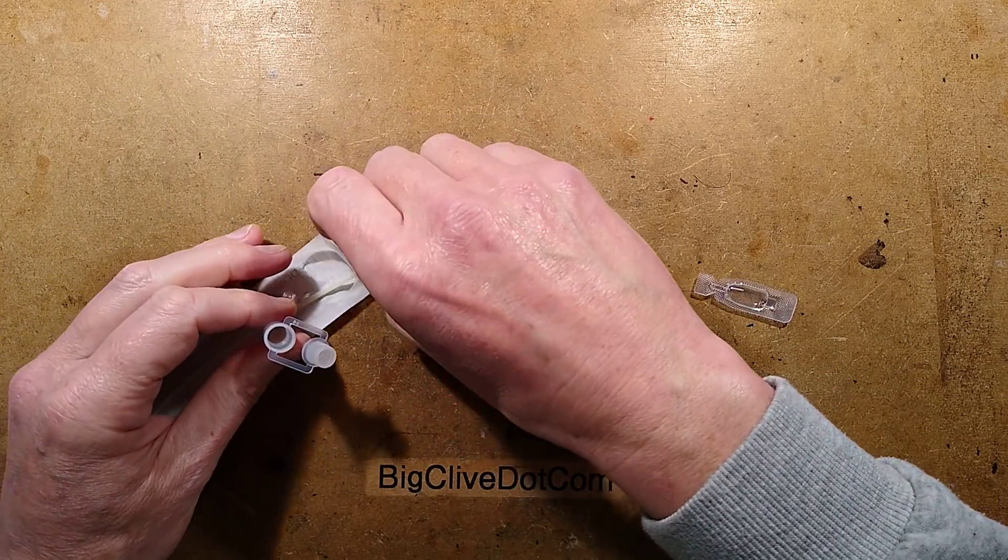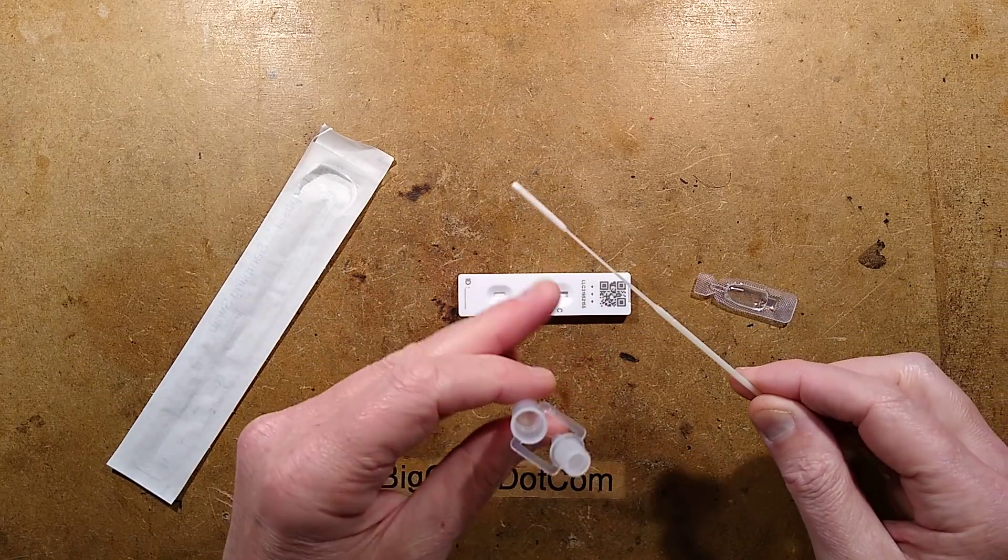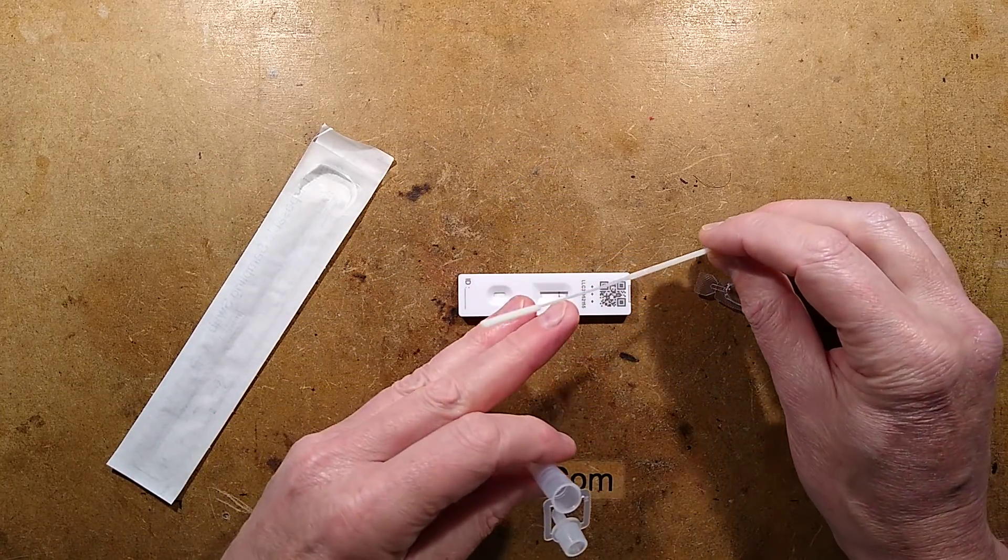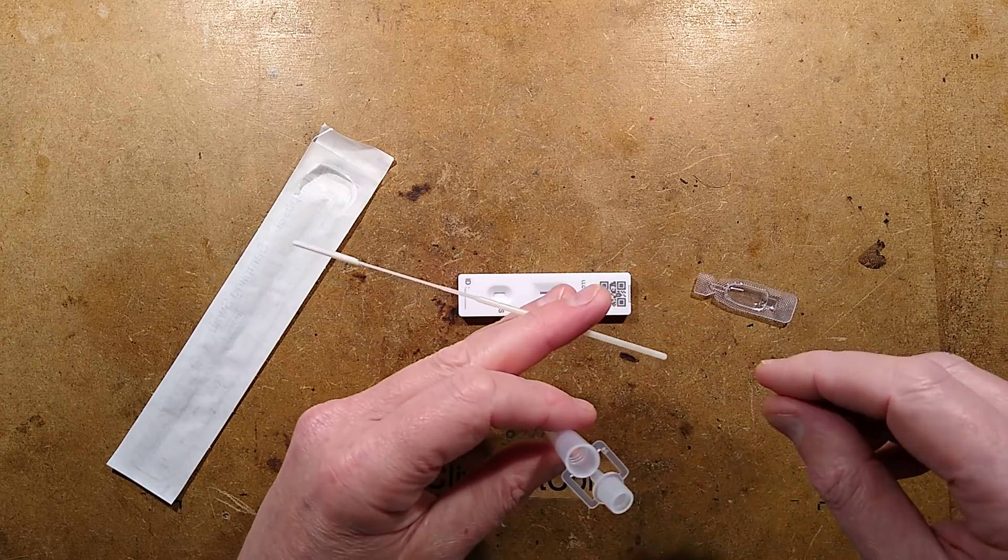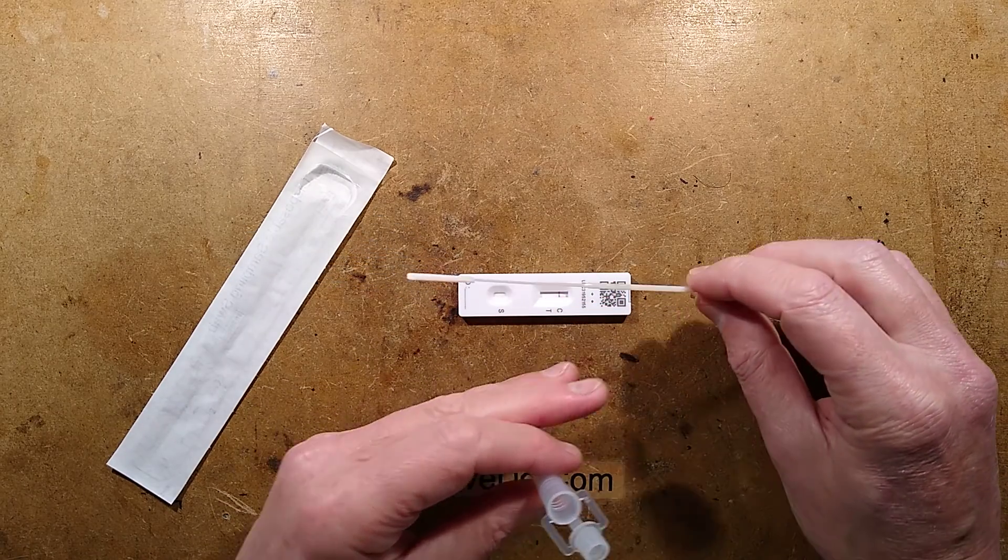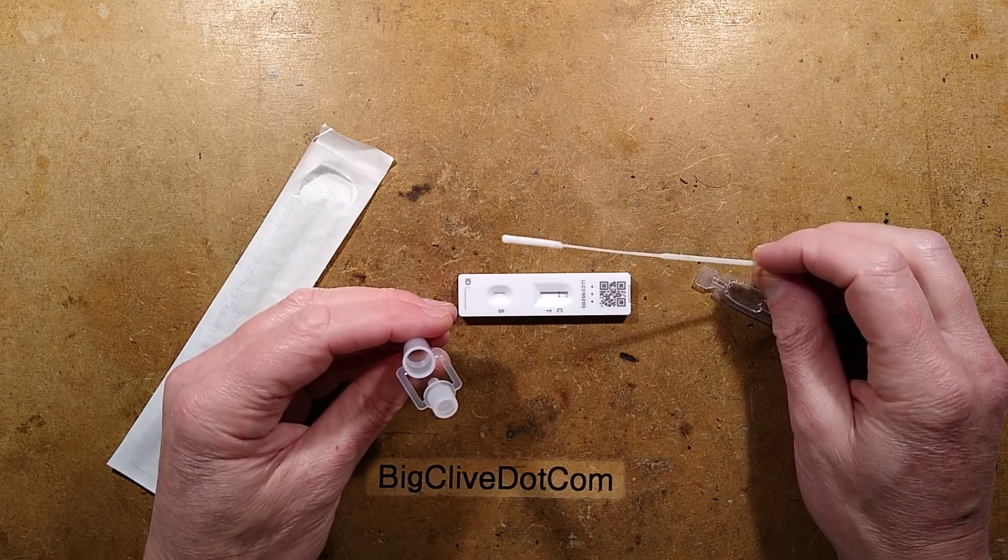And this is absolutely the worst bit - you get this little cotton-tipped swab and you have to stick it into the back of your throat. That's the tonsil area. I don't have tonsils, but that area. And then you rub it around either side. That's when you gag - just about made me throw up.